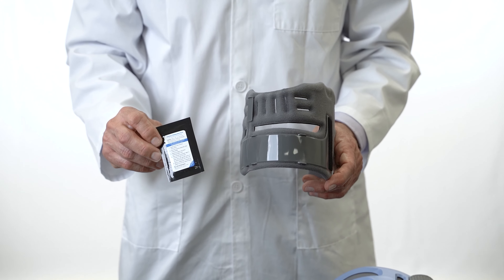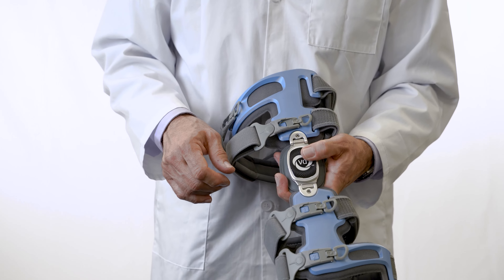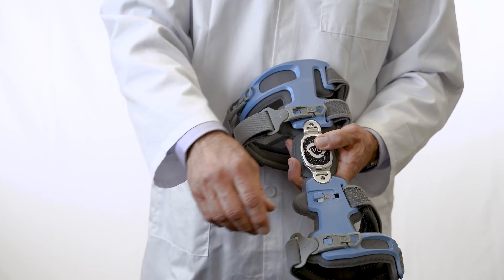The package also includes multiple anterior tibial cuff accessories. Open the brace by lifting up the buckles to unhook them from the frame tab.